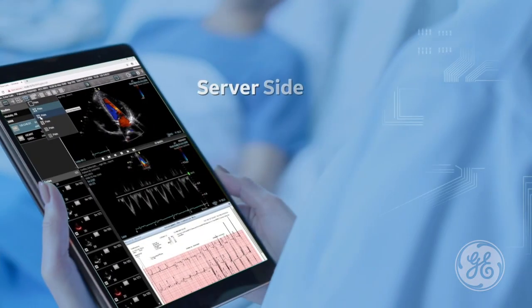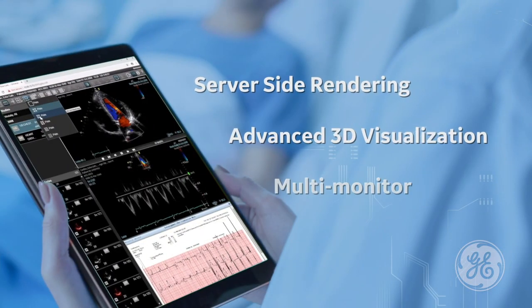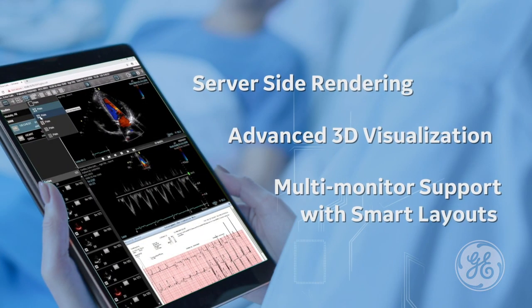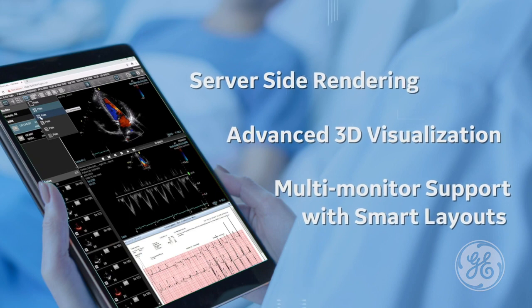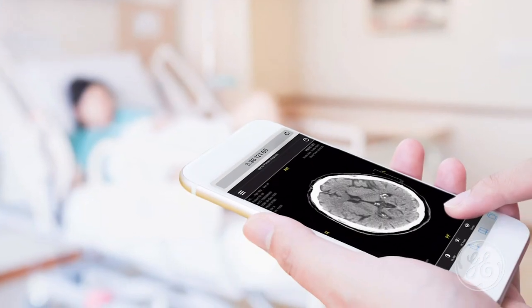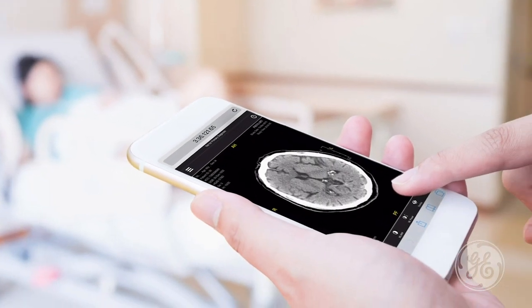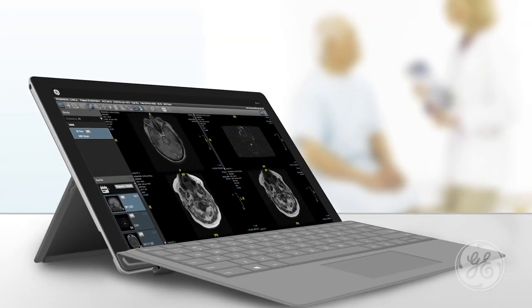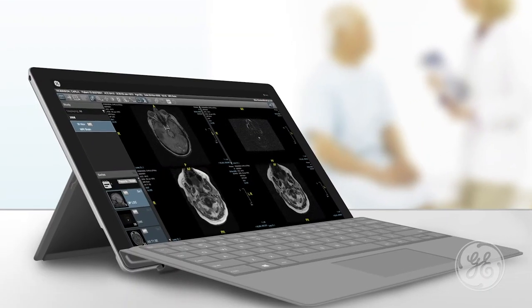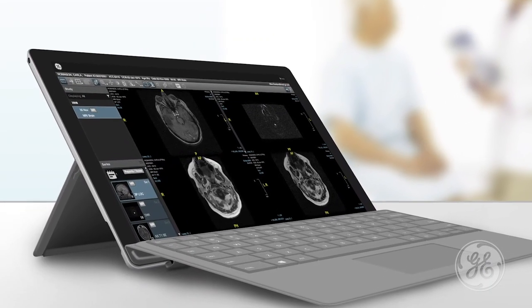By combining server-side rendering, advanced 3D visualization, and multi-monitor support with smart layouts, the GE zero-footprint viewer gives clinicians a high-power and user-friendly platform. The result is easy access to all patient imaging — consistently, logically, and automatically.